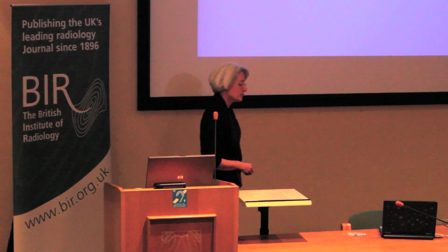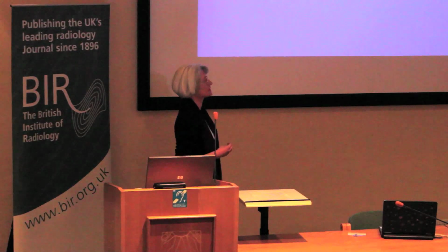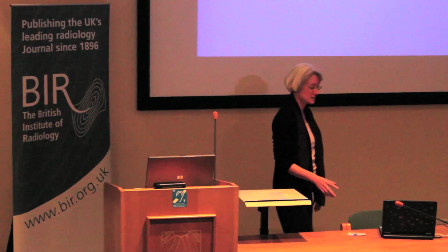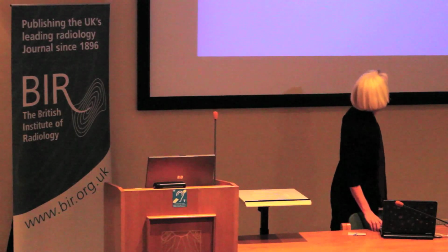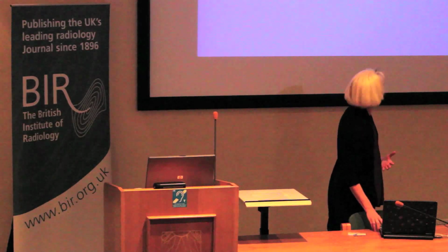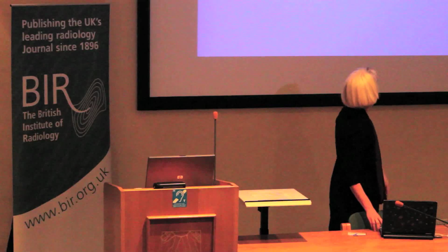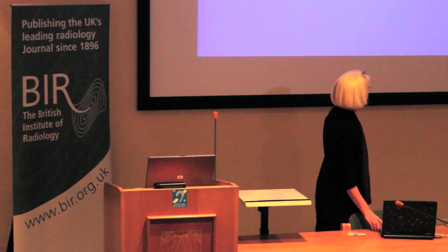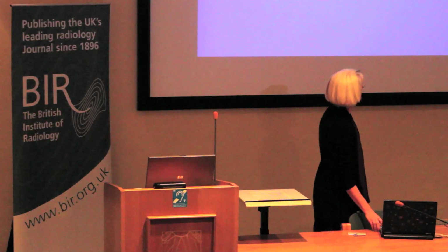Right. Finally, of course, you just have to consider normal MR safety. Now, I apologise for saying this in this room because I know everybody here are experts, but I really want to reiterate these facts. We're talking about scanning anybody really, but particularly pregnant women. You have to consider the normal things that can go wrong. You have to consider acoustic noise. We must make sure the mothers have got earplugs.